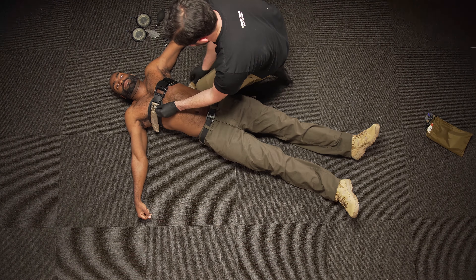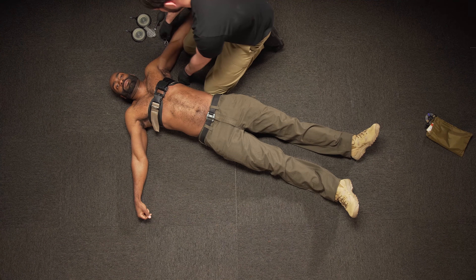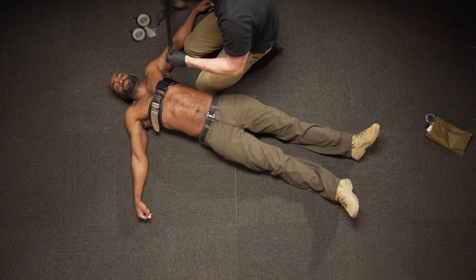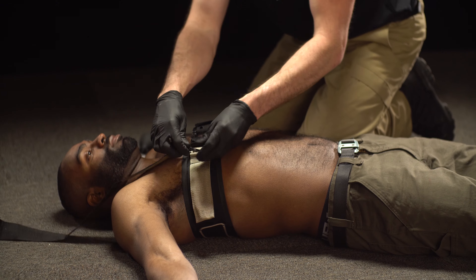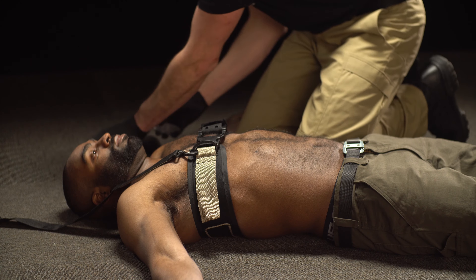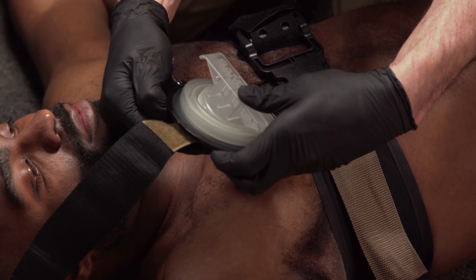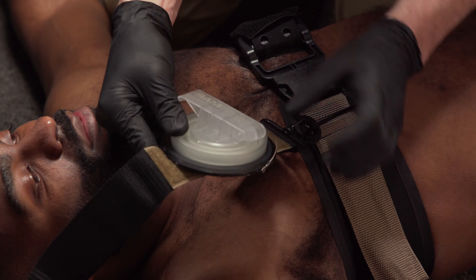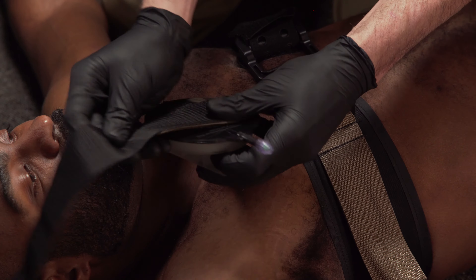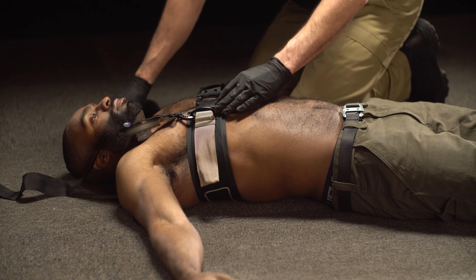Next, locate the auxiliary strap, TCD, TCD extender, and hand pump. Attach the auxiliary strap to the D-ring on the belt. Place the TCD on the strap centered on the light brown Velcro — the tube and hand pump should extend out laterally. Connect the larger plastic clip of the auxiliary strap to the D-ring on the front of the belt.